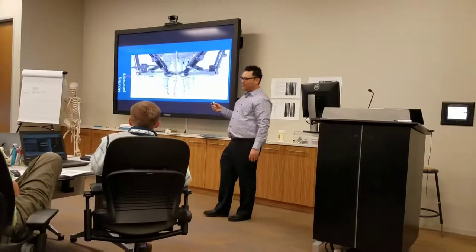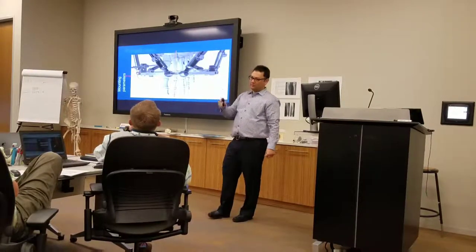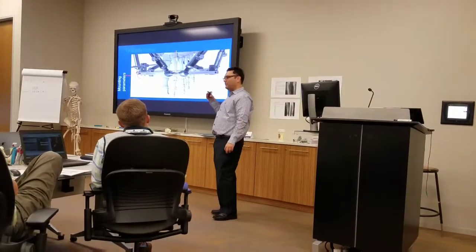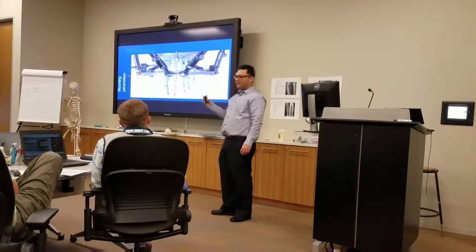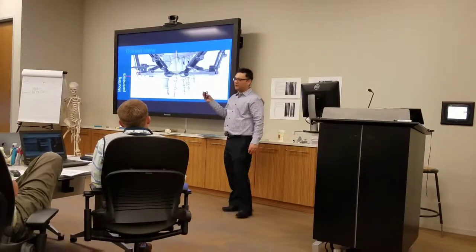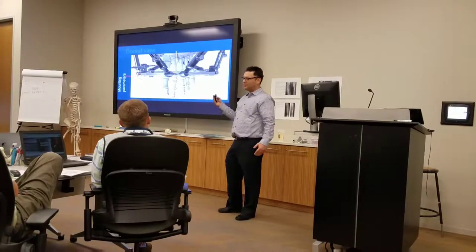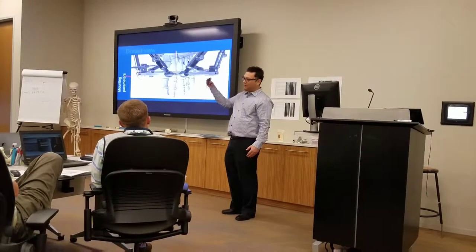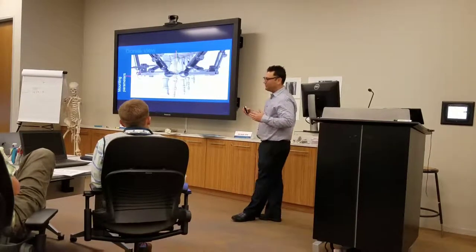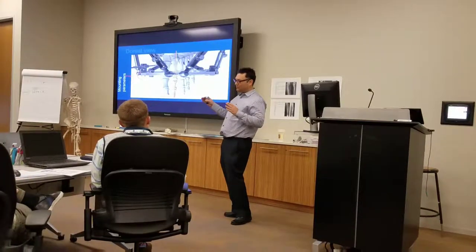The second thing you have to do that overrides these angulations and everything, and Alex, you can correct me if you don't like anything that I say at any time, is recognize where you're correcting through. That means if you're going to make an osteotomy on the talus and put your frame on the metatarsals, don't come crying to me saying, why is it pulling apart the metatarsal cuneiform joints and I'm not getting any correction through the talus? You've got to have those wires right up against where the osteotomy is. So you have to use strong principles, and I would not harp on saying get that frame straight, 0 degrees, 0 degrees.